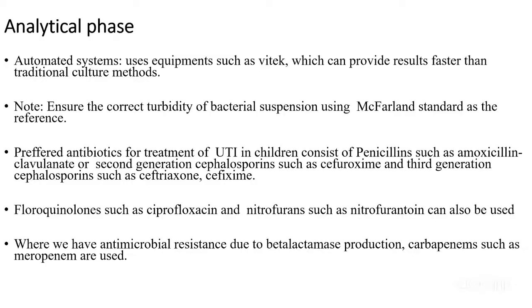When we are doing antimicrobial susceptibility testing, we also check the drugs that we use. We will not just do antimicrobial testing on any drug. That's why it is important when you are running antimicrobial susceptibility testing, you should know which kind of bacteria you are dealing with. It's either gram-positive or it's gram-negative, because the drugs for gram-negatives, most of them do not work for gram-positives. And most drugs for gram-positives do not work on gram-negatives.